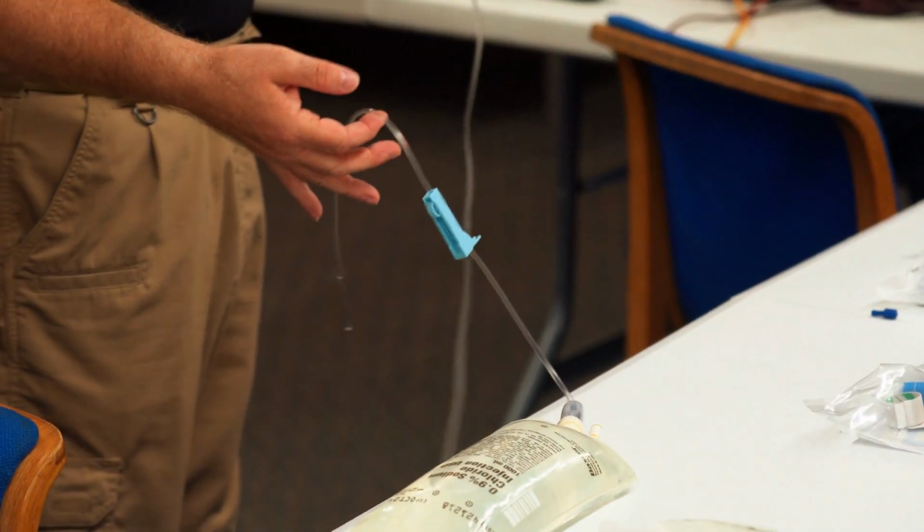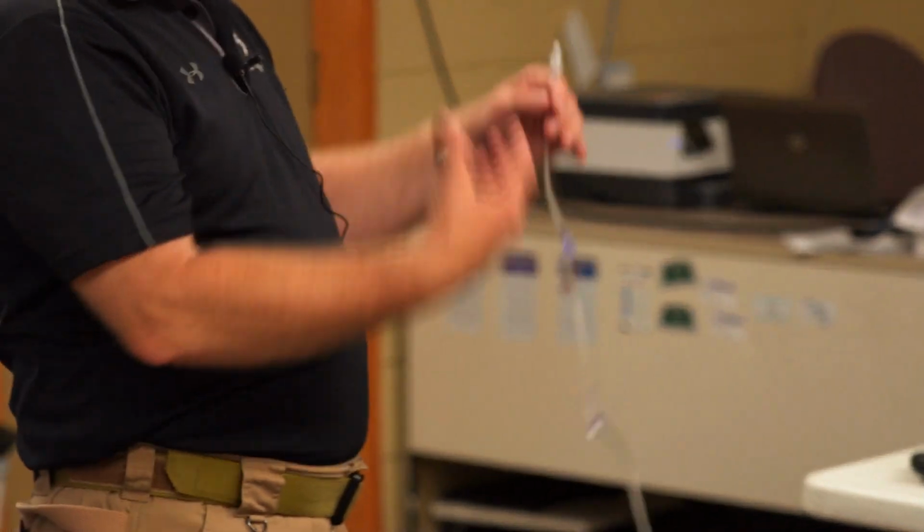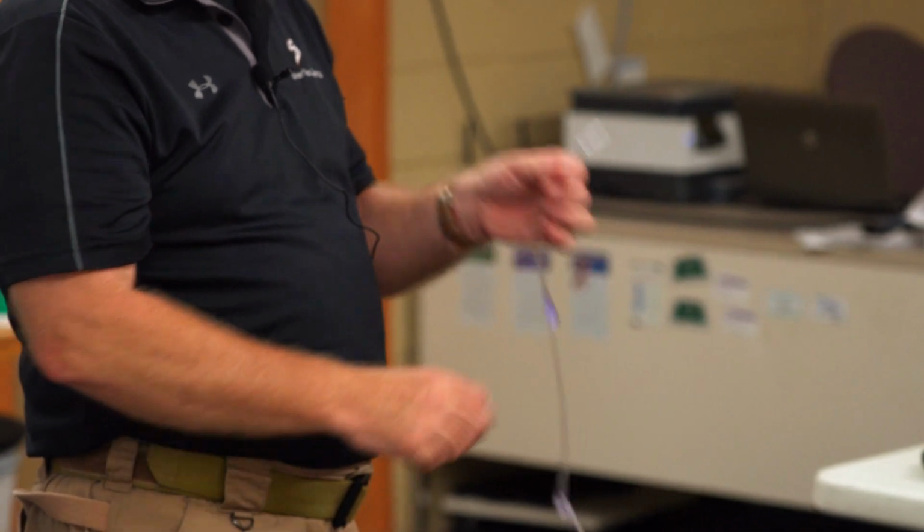So that's your setup. For the EMRs and EMTs, this part is well within both people's scope. And in fact, the EMRs helping the EMTs might be able to buy us a few extra minutes while we're digging around looking on the arm, okay? There's your IV setup. Now, 250 bag, 500 bag, 1,000 bag. It's entirely possible that maybe liter bags aren't available, so you're going to get a 500 bag.